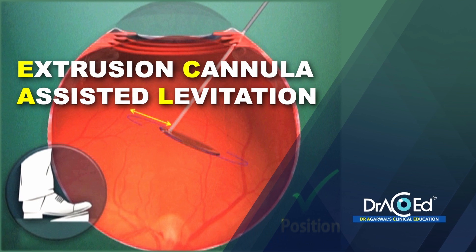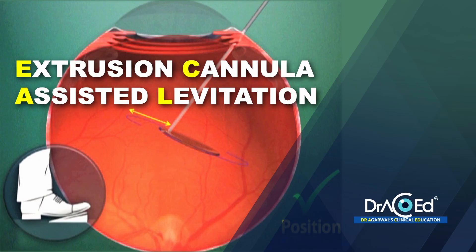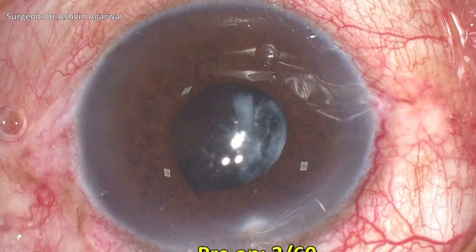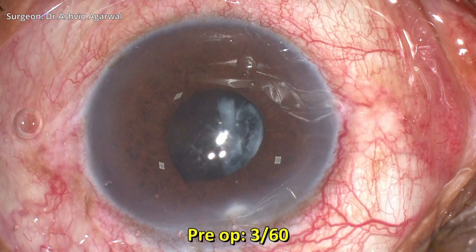Dr. Ashwin demonstrates the extrusion cannula assisted levitation technique, also known as ECAL, to retrieve an IOL which has dropped onto the retina. This is a 60-year-old patient who came with a posteriorly dislocated three-piece IOL and a pre-op visual acuity of 3 by 60.